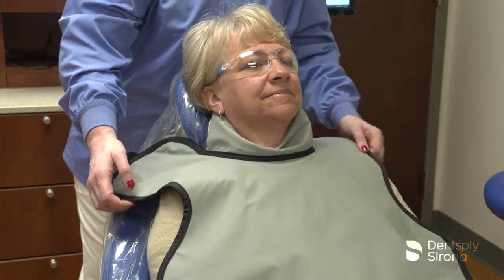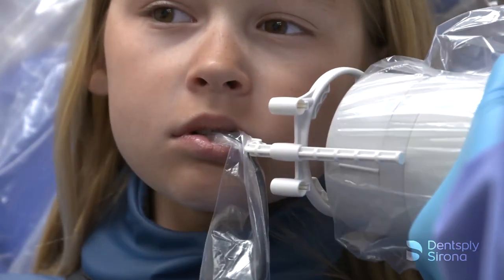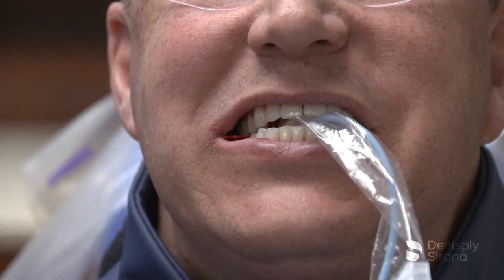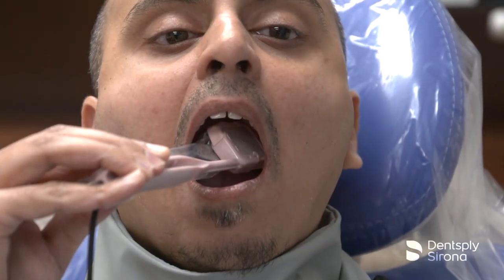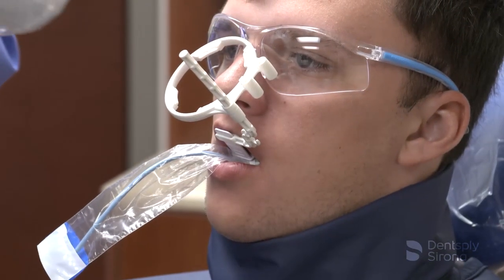Dental radiographic exams are one of the primary diagnostic tools to determine disease states and to formulate the appropriate treatment. Radiographs should be prescribed according to selection criteria guidelines. These guidelines are based on a variety of factors including the patient's medical and dental history, clinical signs and symptoms of disease, risk factors, age and dentition, and new or recall status.